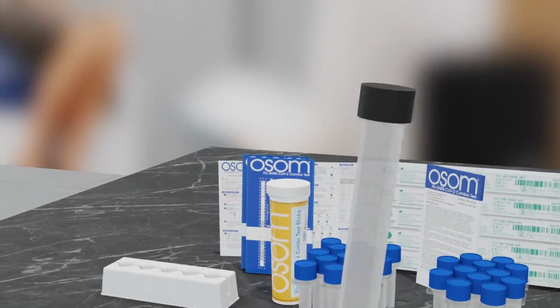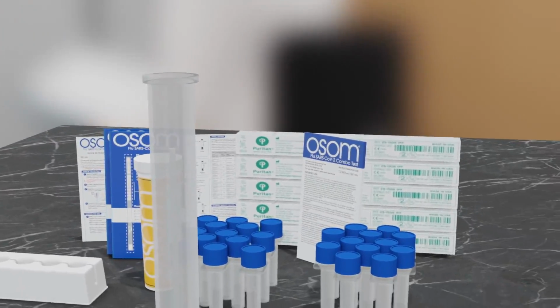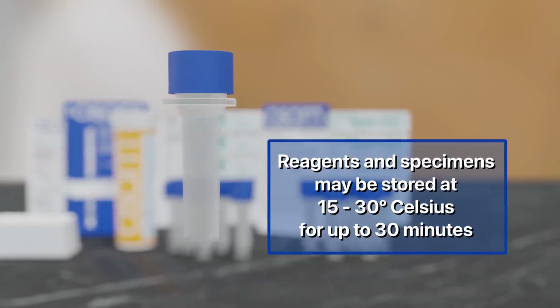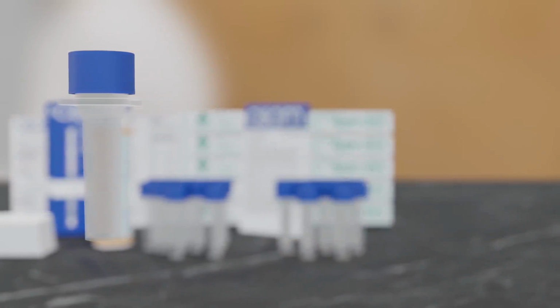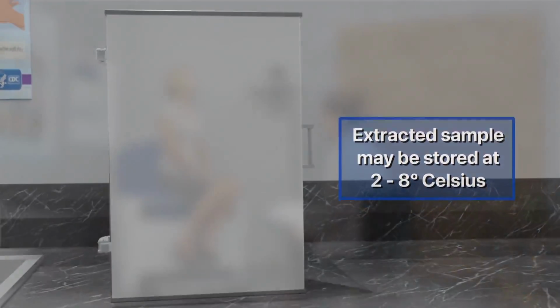To transport patient samples, place swab in a clean, dry container, such as a plastic or glass tube. Once the swab has been mixed in the extraction buffer vial, the extracted sample must be used within 30 minutes when stored at room temperature, 15 to 30 degrees Celsius, or refrigerated, 2 to 8 degrees Celsius.